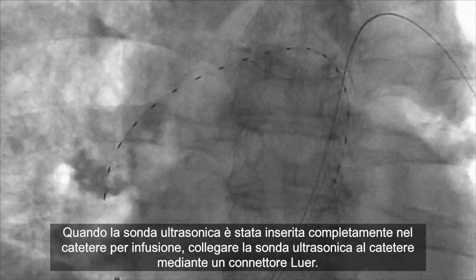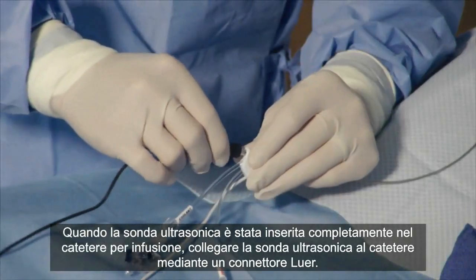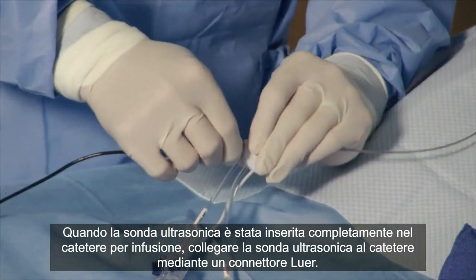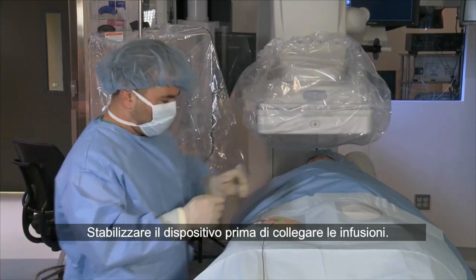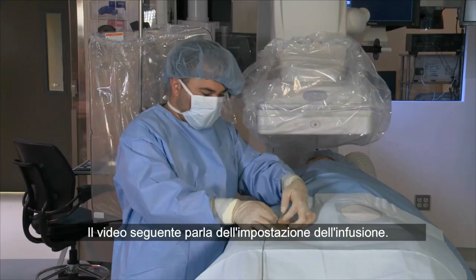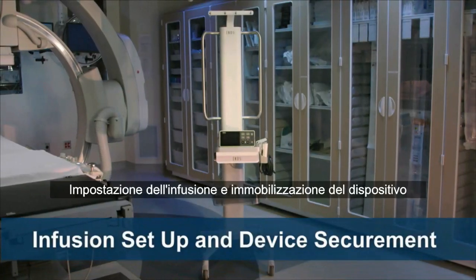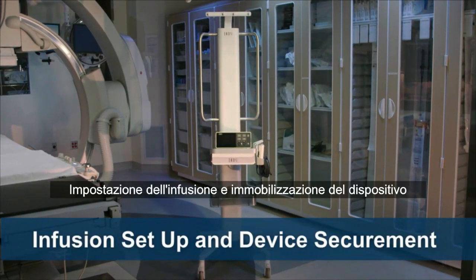When the ultrasonic core has been fully advanced into the infusion catheter, luer lock the ultrasonic core to the catheter. Stabilize the device prior to connecting infusions. The following video discusses infusion setup and device securement.